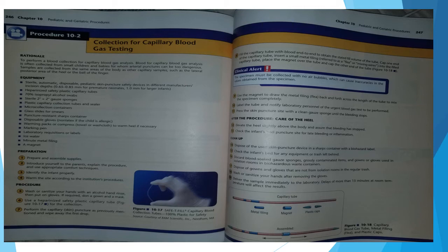Discard blood-soaked gauze, sponges, grossly contaminated items, and gowns or gloves used in isolation rooms in biohazardous waste containers. Dispose of gowns and gloves that are not from isolation rooms in regular trash. Wash or sanitize your hands after removing gloves. Deliver the sample immediately to the laboratory. Delays of more than 15 minutes at room temperature will affect results.